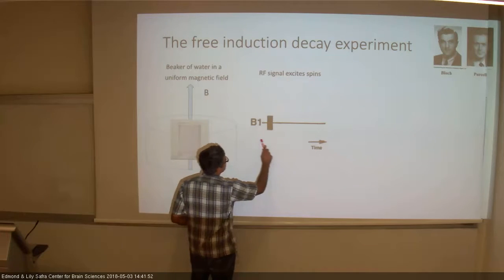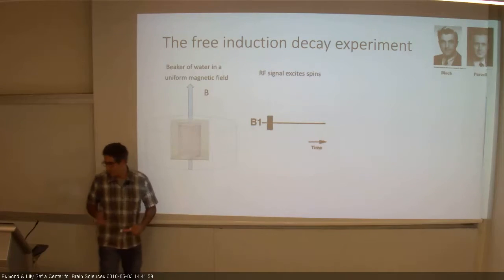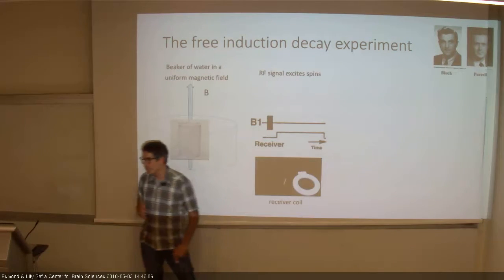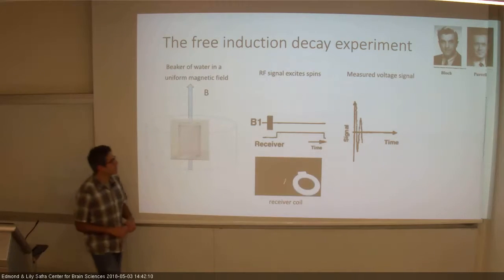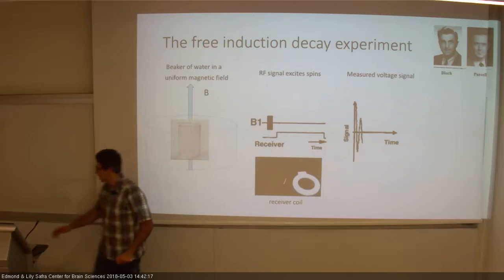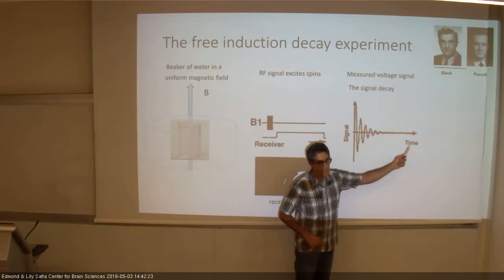So for some time, so this is time, they open the excitation, right? They transfer radio frequency to the system, and then they use a receiver. So they listen to what would happen now. They put a receiver near the system, and they found that it's starting. They find a signal going up and then going down as we expect, and then it's dying. Going up, going down, going up, going down, going down, gone.